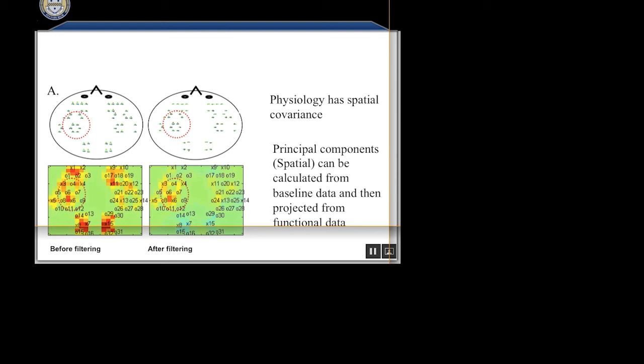And I would argue that the statement, and this is knocking my own work, the statement of I removed two components because what was left was the motor cortex probably isn't a good answer, because you remove the number of components until you saw what you wanted to see is probably not the best way to do science. So one of the problems with PCA or ICA becomes how do you identify which components to remove and how many. And so we recognize this.